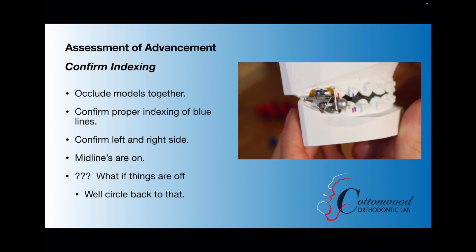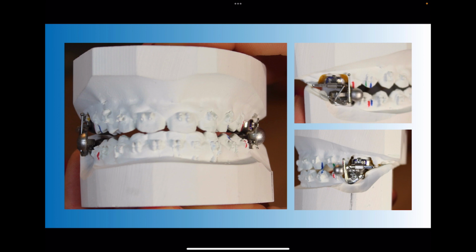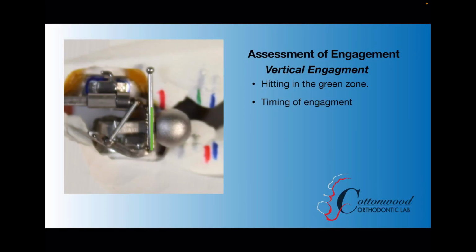The next photo is going to show all three of these photos in a little detail. I'll leave it there for a few seconds for you to kind of enjoy. Once again, you notice midlines are straight on, and then your left and right blue marks are accurately hitting. So sometimes you get lucky. Sometimes you have to do this 3 or 4 times. You have to move those around. So we're going to talk about how we adjust this. So the next thing is you also want to assess how you're hitting the elbow against that cam.